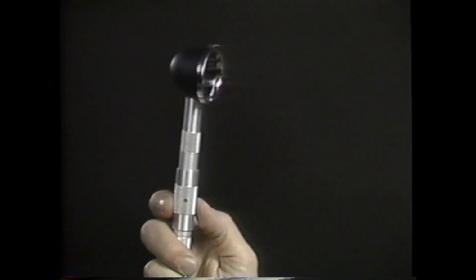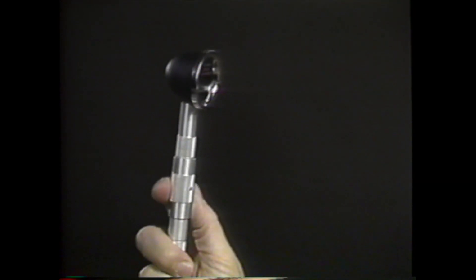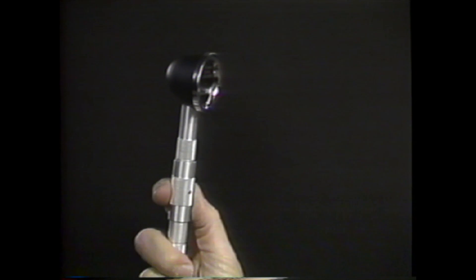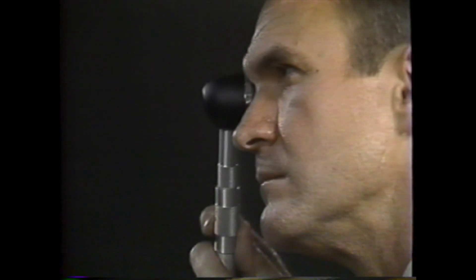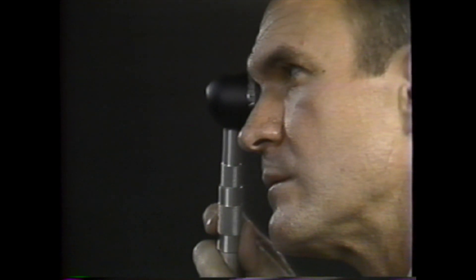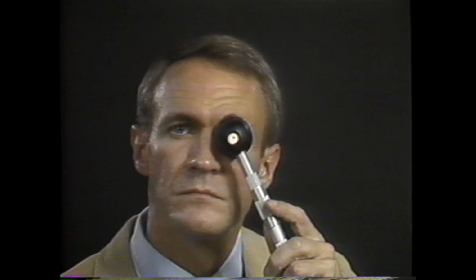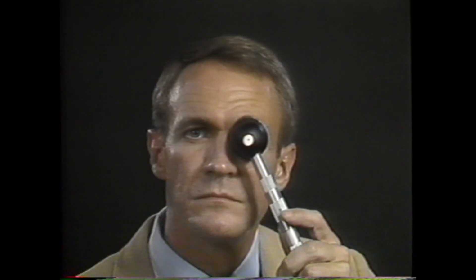The retinoscope should be held with one hand, using the thumb and forefinger to hold the sleeve in the up position and to rotate the sleeve when necessary. The rim of the scope should be steadied against the brow, with the examiner looking through the peephole at the eye to be retinoscoped. As with direct ophthalmoscopy, the examiner's right eye is used to retinoscope the patient's right eye, and the examiner's left eye is used to retinoscope the patient's left eye.